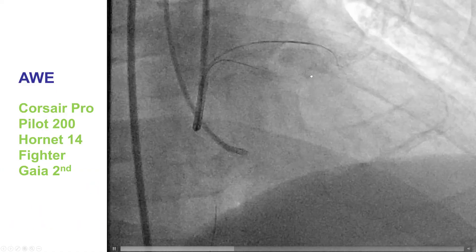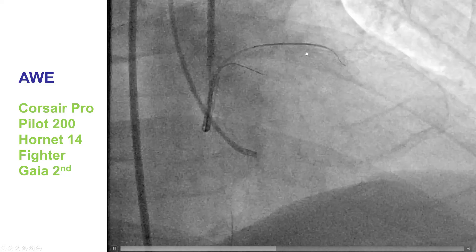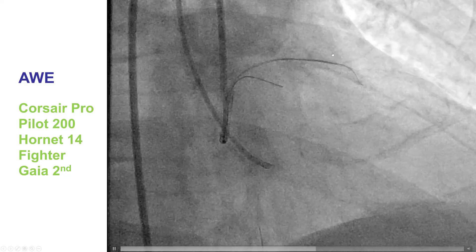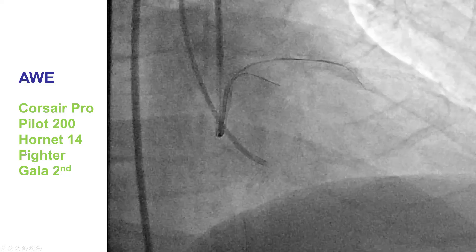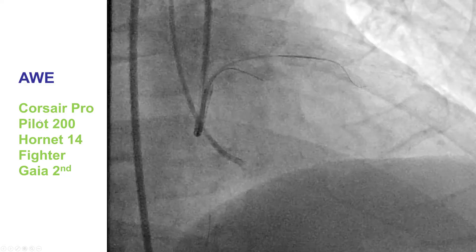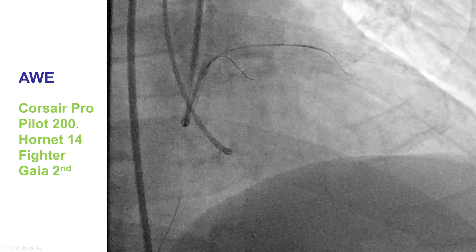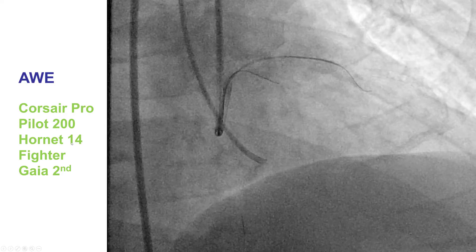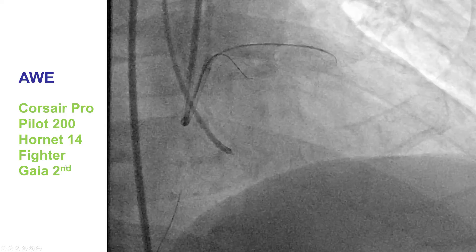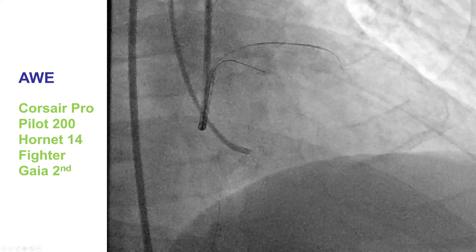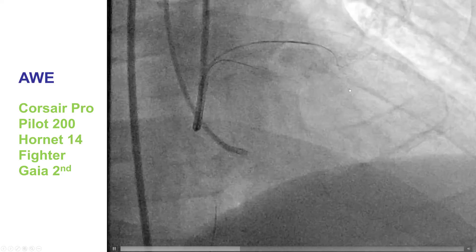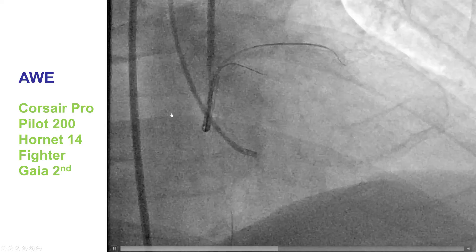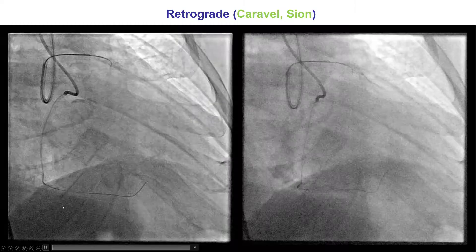We tried antegrade wire escalation over the Corsair Pro microcatheter, trying different wires including the Pilot 200, the Hornet 14, the Fighter, and the Gaia 2nd. However, we were unable to cross into the distal true lumen.